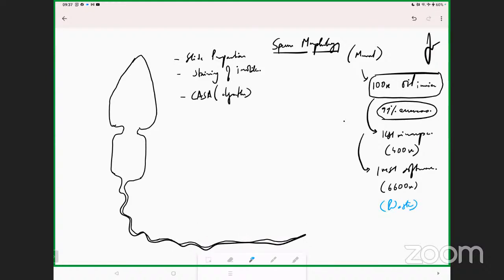At one point in time, because I was doing a lot of IVF cycles, especially male infertility cycles, and we were having a lot of workload of poor sperm morphology, we thought we will invest in IMSI, that is the intracytoplasmic morphological assessment of sperms, and then injecting them. But we have realized that it is a waste. The 16 lakh rupees which we spent at that point in time on a software called Octax has not really helped us. It is a waste in my humble opinion.